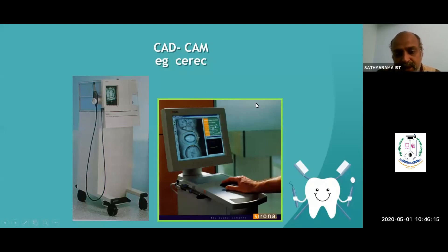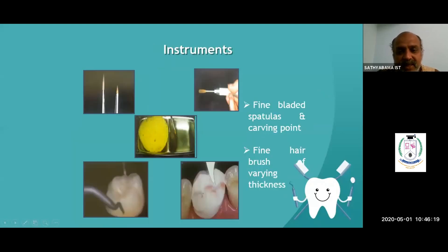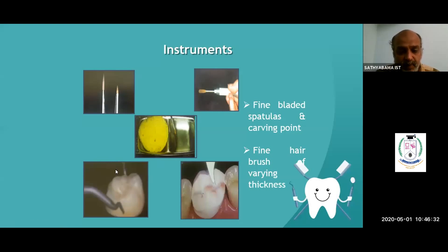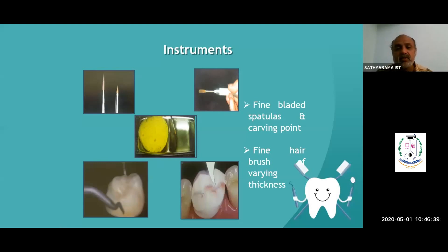The computer design is then fed into the milling part. These are the various instruments used for ceramic work: you have a fine blade spatula or carving point — you can see the tip of the blade is very fine — and you have a brush specifically for ceramic.